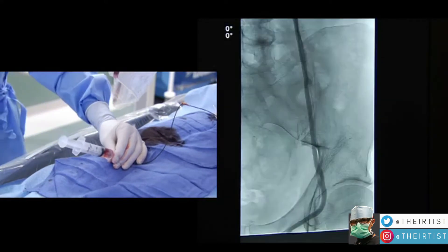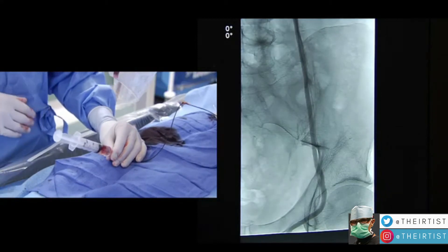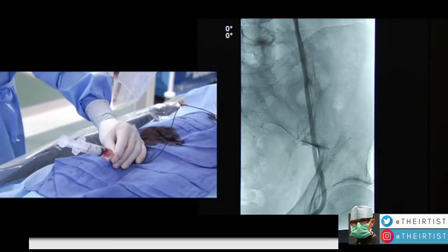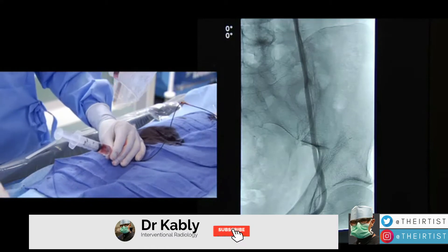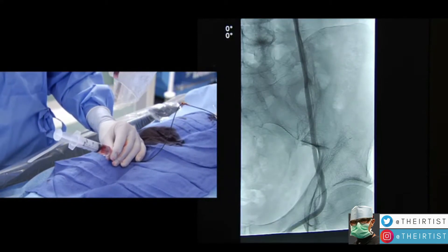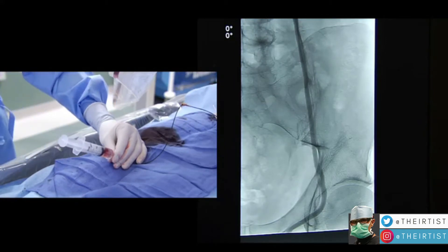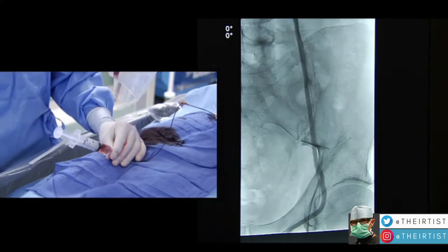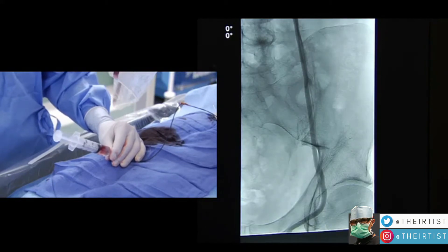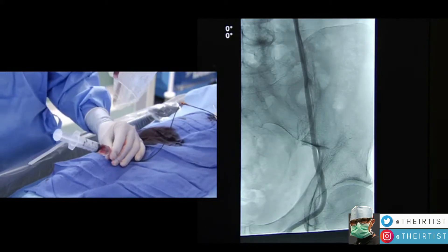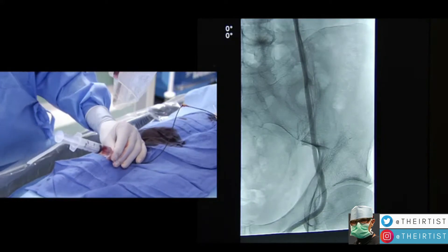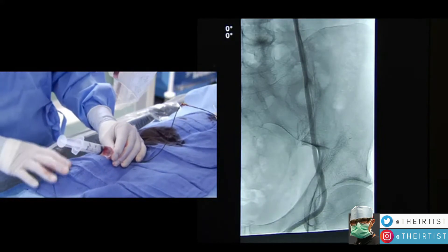It should be noted that at no point are the patient's testicles directly exposed to the X-ray beam, thanks to proper collimation and image centering. For patients particularly concerned about radiation, shielding material can be placed to protect the gonads during the procedure. As the physician is doing here, there is no need to image the testicles directly.